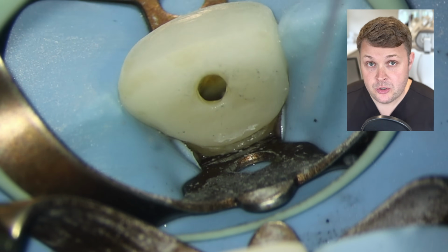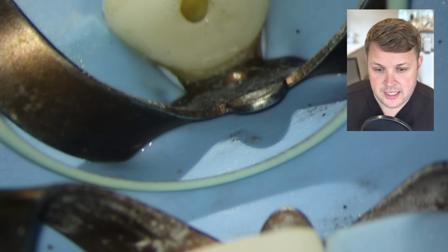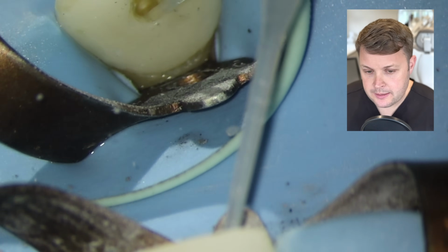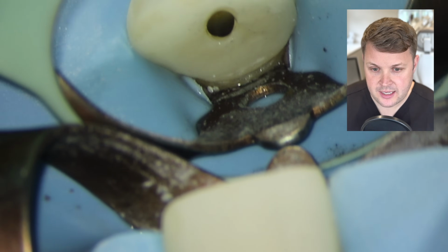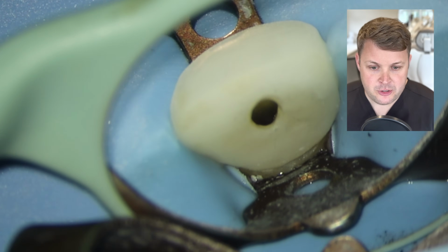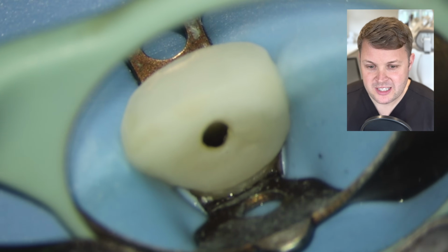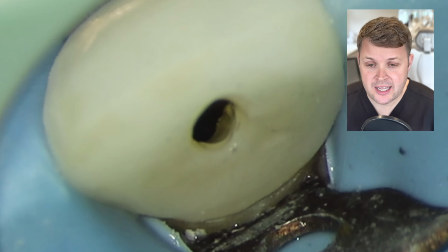I personally, using a microscope, like to see the vast majority of the canal, and if this hump, this lingual shelf, is in the way, then it obscures your ability to see the canal space itself. And after we've done all of our investigation here, all of our lingual removal, we can see that hump is completely gone, and we can see the vast majority of the canal.